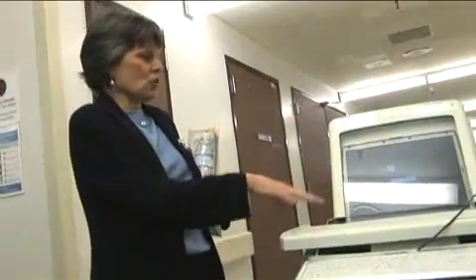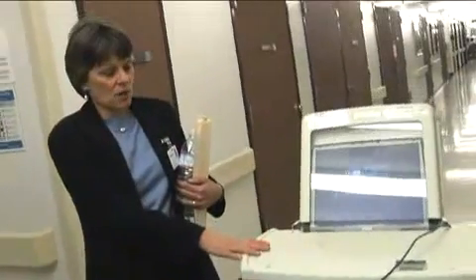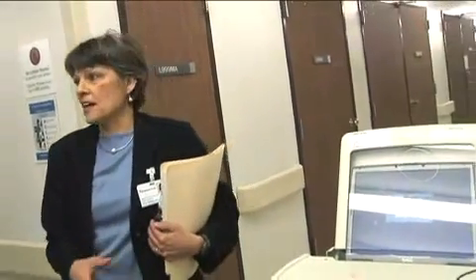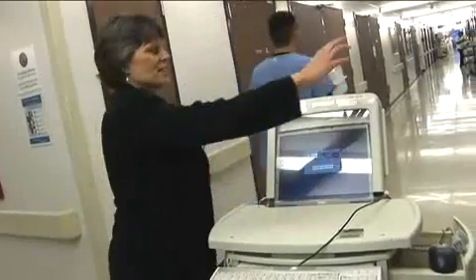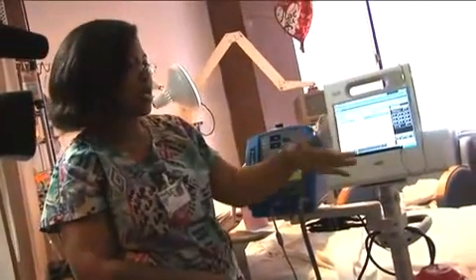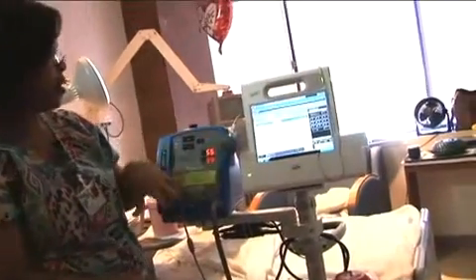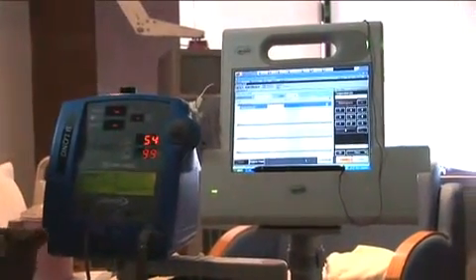So this is the current device, and there's no ability, at least on this device right now, for a barcode scanner. It could be done. And when we first put this into place, the nurses said, if I have to wheel this around, we'll show you in a minute a Dynamap, which is our automatic vital sign retrieval device. It's like, why can't I just have the Dynamap sitting here and just have it all interactive? And that's what we're doing with this tablet. This is the machine that we use for patient assessment. All the information we need is in here, and then we just add in more information to it with the Dynamap for the blood pressure readings.